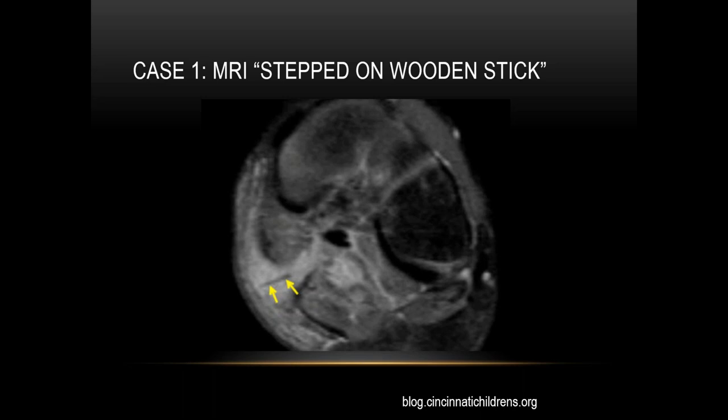Here is a patient who stepped on a wooden stick. You can see the low signal intensity linear foreign body in the subcutaneous tissues with surrounding edema.